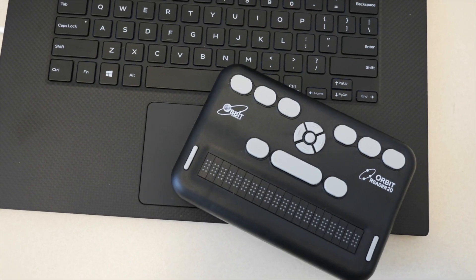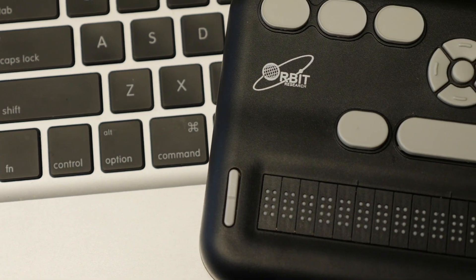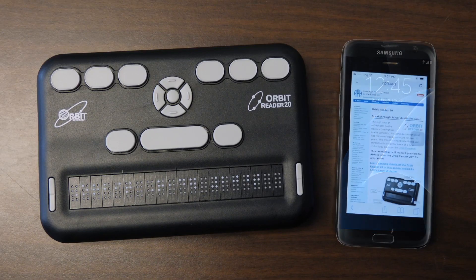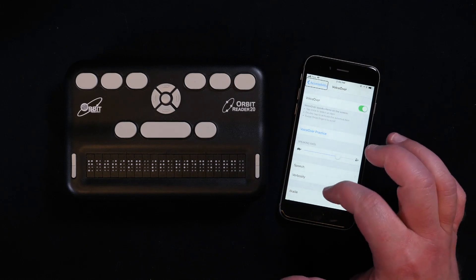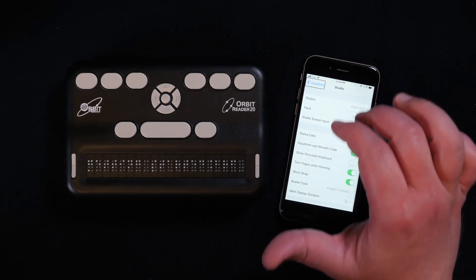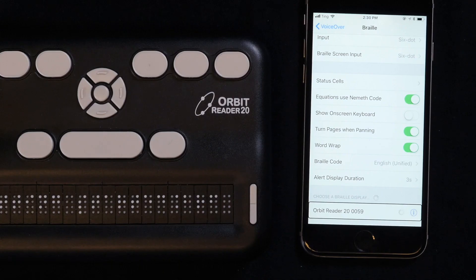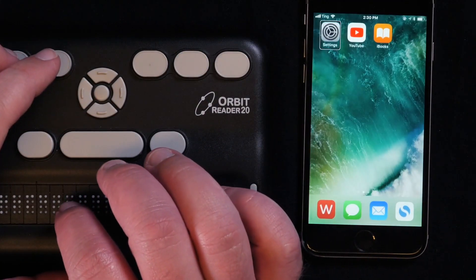The second mode for accessing content on your Orbit Reader is Remote Mode. With this, you can connect or pair your Orbit Reader to any other device that has a screen reader. When you use your Orbit Reader as a braille display for another device, the screen reader on that device provides the translation and other braille settings, translating text into the braille code of your choice.